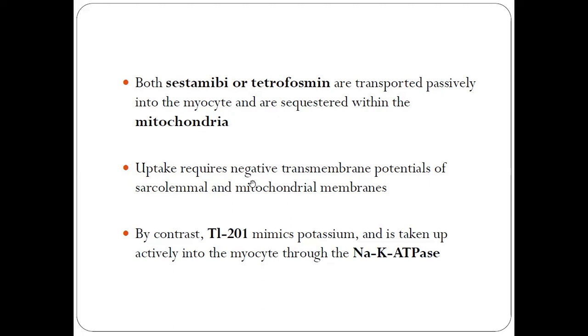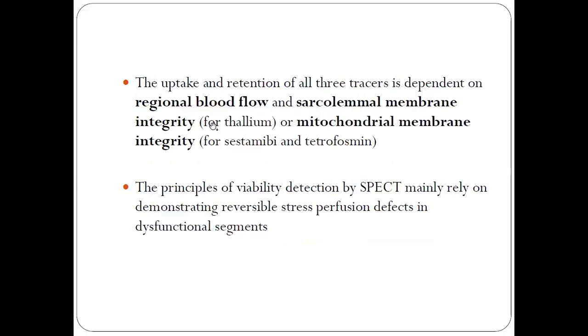Otherwise, if the tissue is dead, the mitochondria will also be dead. So this tissue will not be able to take up sestamibi or tetrofosmin, and thus denotes non-viability. However, thallium-201 mimics potassium and is taken up actively into the myocyte through the sodium-potassium ATPase. So uptake of thallium-201 depends upon the sodium-potassium ATPase, whereas sestamibi and tetrofosmin are dependent on the myocyte as well as the mitochondrial membrane integrity.